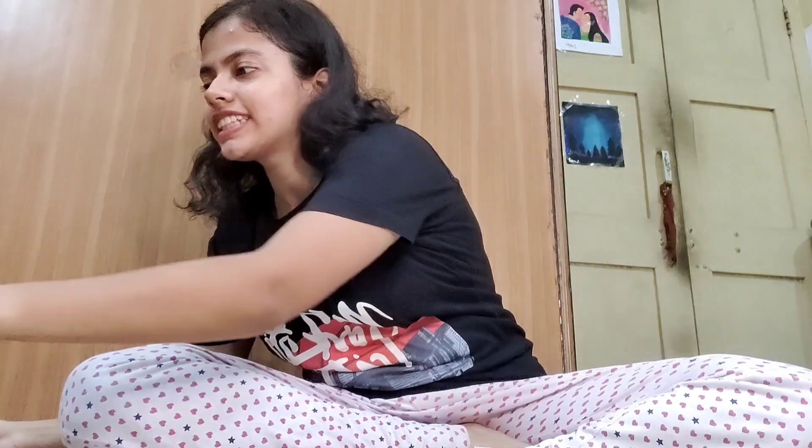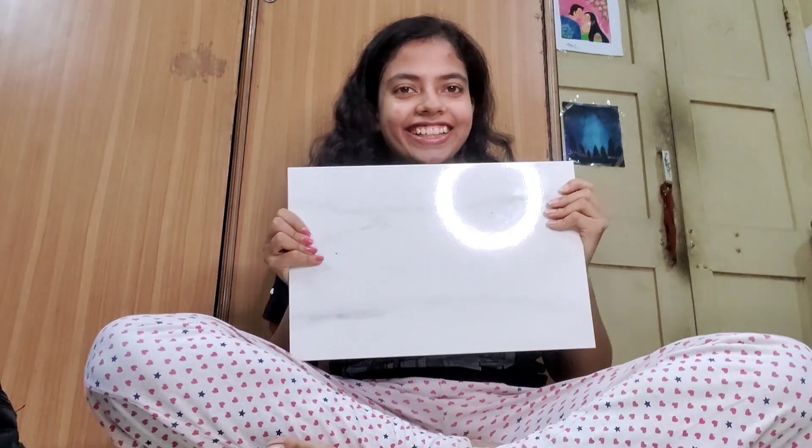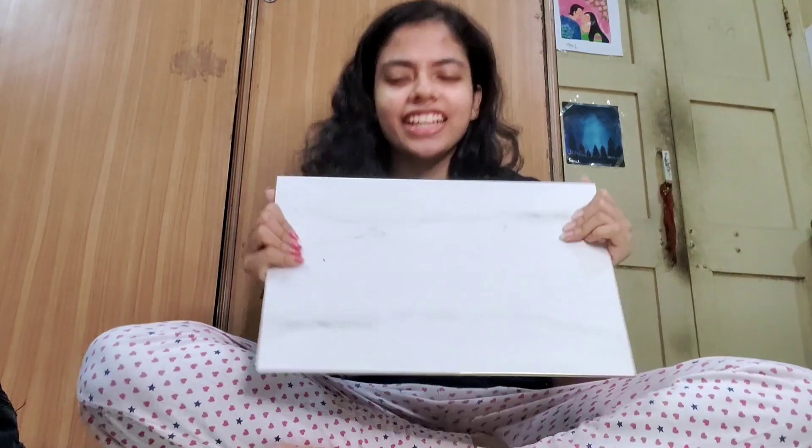So in the Prosthodontics kit, first I found this big tile. I think it's just for providing stability while we work, like a table surface to keep things on.